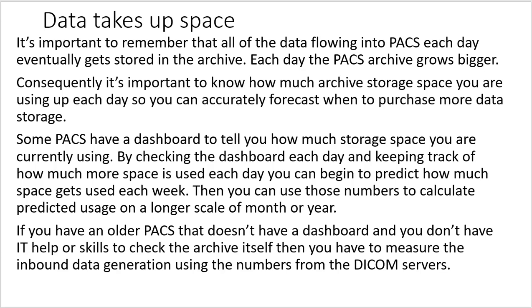Some PACS have a dashboard to tell you how much storage space you are currently using. By checking the dashboard each day and keeping track of how much more space is used each day, you can begin to predict how much space gets used each week. Then you can use those numbers to calculate predicted usage on a longer scale of, say, a month or a year.